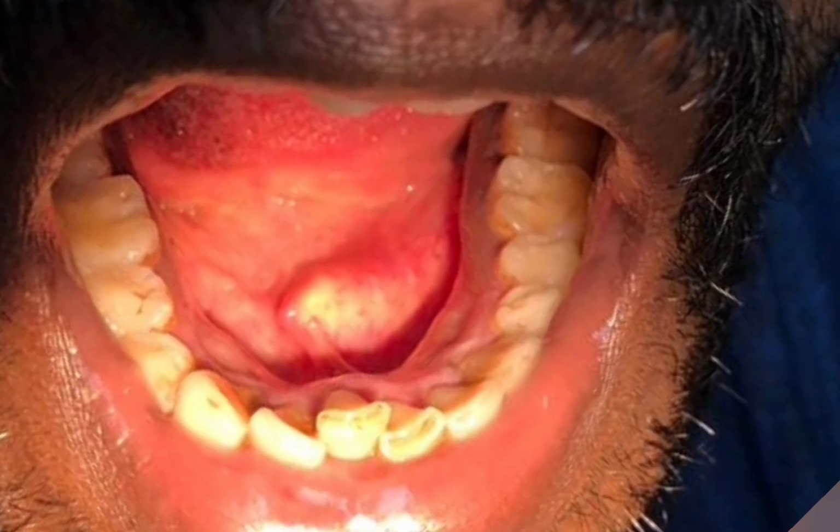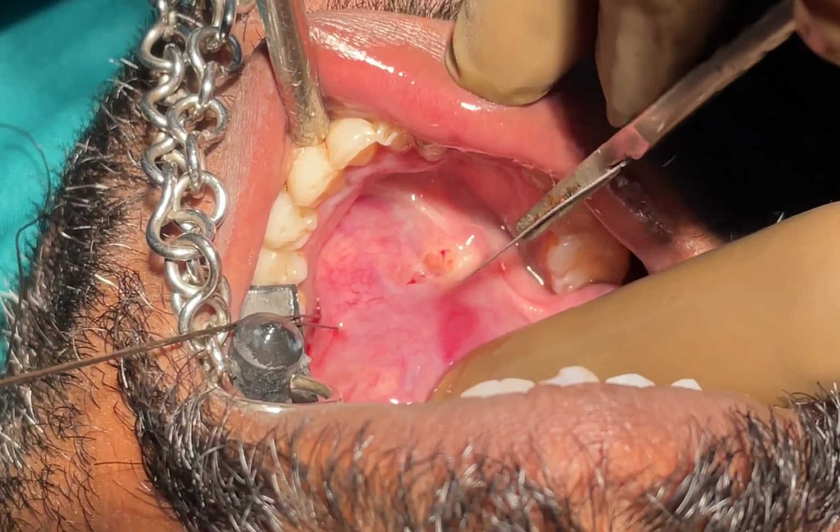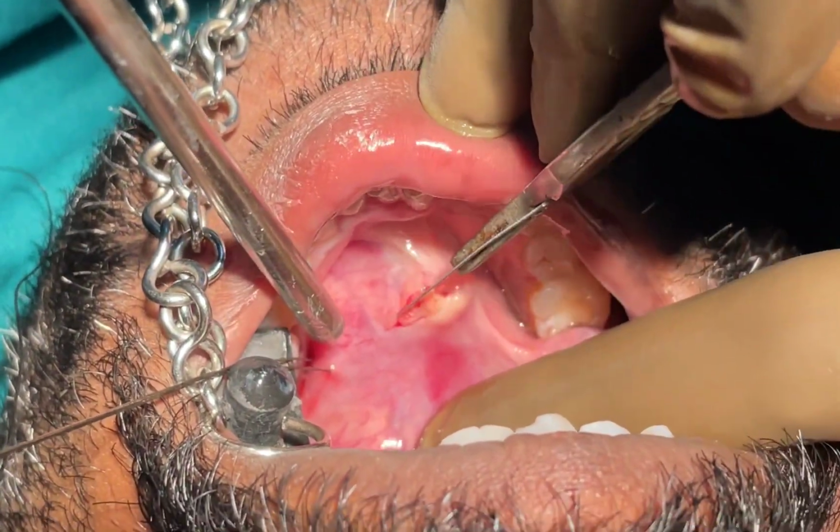So the management would be surgical excision of the stone within the duct. If the stone is within the gland, the other option is to do a lithotripsy or excision of the salivary gland. So now we can see the procedure for the excision of the submandibular salivary calculus.